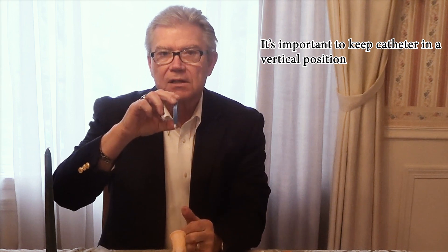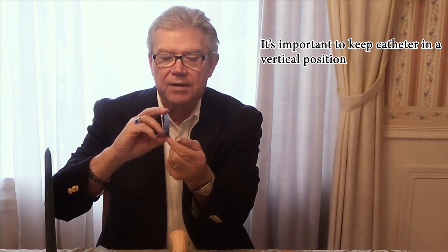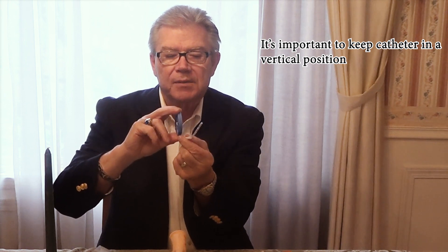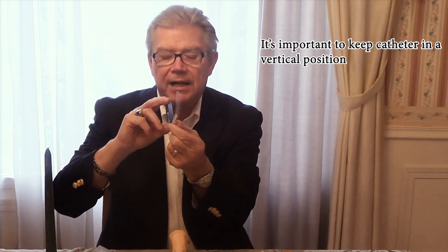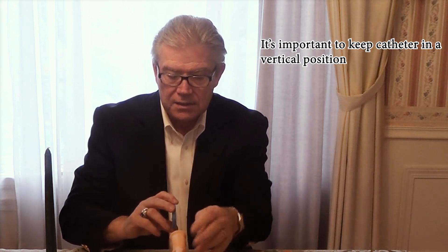For normal insertion of the catheter, hold it first of all by the edges. Do not hold it by the sides because the wheel rotates on the side as you're inserting and pulling the catheter out. You want to hold the catheter like this and make sure that it's always in a vertical position. Then you simply pull the catheter out and move the sleeve back about three or four inches to expose the eyelets, and then you can go ahead and insert it into the penis.